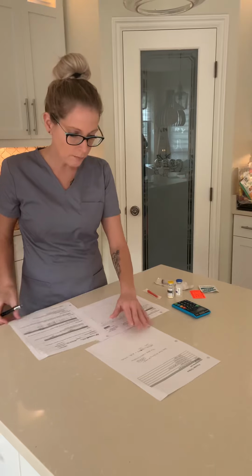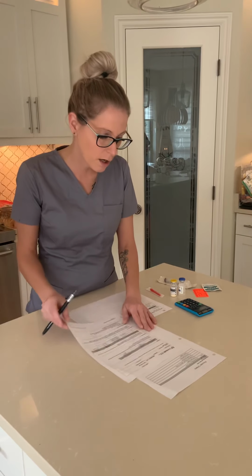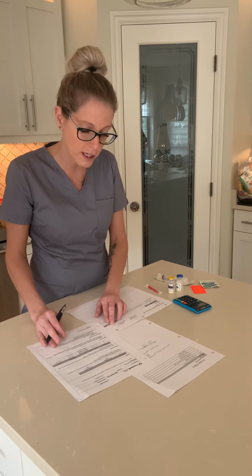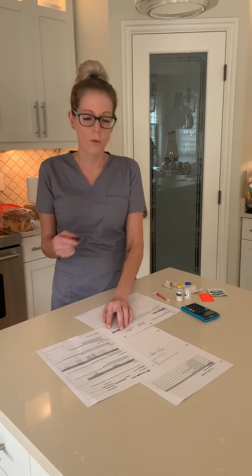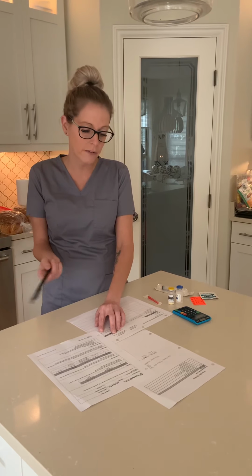So this patient is 4.7 kilograms and the baby is 12 days old. So in order to determine if I was going to use the neonatal profile versus the pediatric, I could have asked the expected date of delivery, or I could have checked the EMR to see how many weeks mother was when she delivered. This baby is under 45 weeks, so I have chosen the neonatal profile to go ahead.